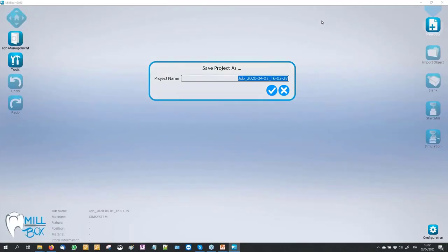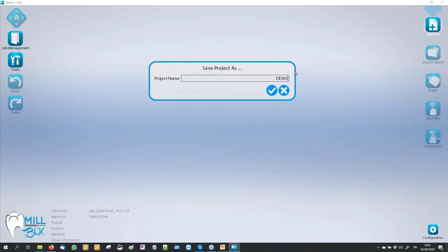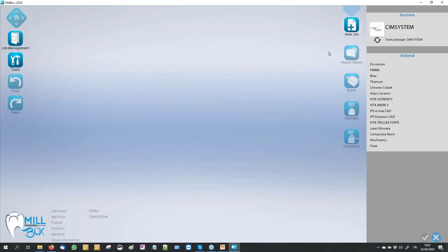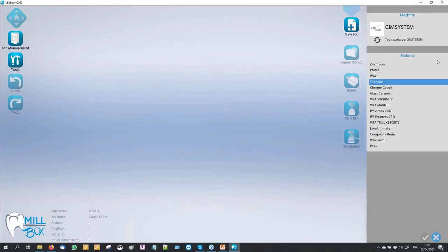We can start with a new job. The software proposes a name for our job, but of course we can introduce our personal job name. This is automatically opened — this is the right bar. The software shows us how many machines we have in our configuration. Now I have only a fantasy machine, CIMSYSTEM.